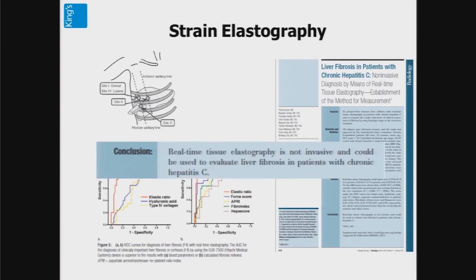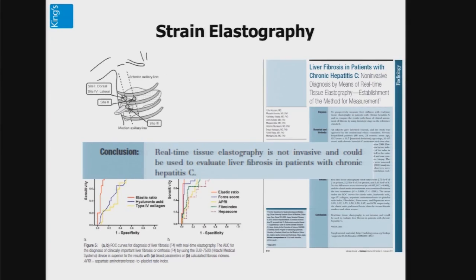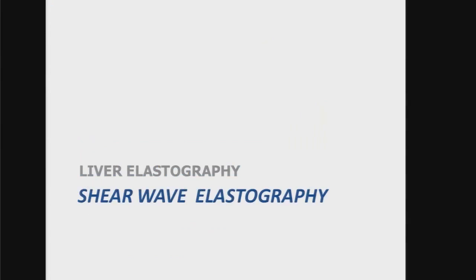So it's a useful test, again, to look for fibrosis, and it can quantify the degree of fibrosis by using those histogram measurements. Slightly more difficult to use than the next few examples I'm going to show, because you are using a linear probe, you're angling it up towards the heart, and you're relying on visualizing that liver against the heart and looking at those pulsations.